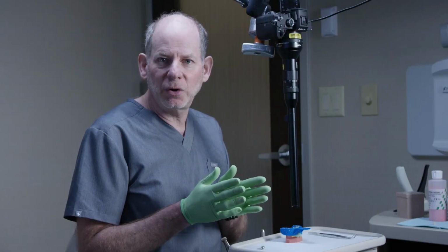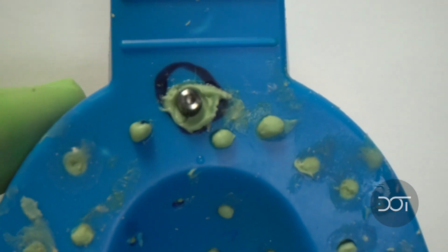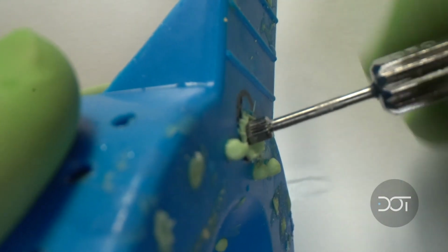With this impression material, it's a fast set Aquasil. It's a 4-minute set time. So 2 minutes working time, 2 minutes in the mouth. Now that the material is set up, we can go ahead and we can see how clean the screw is, which is really nice, makes it much easier for when we're going in with our driver. And we'll loosen that up.